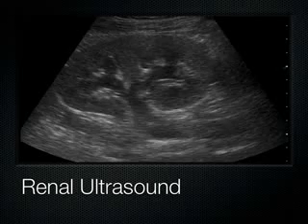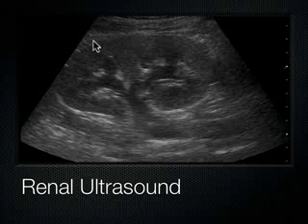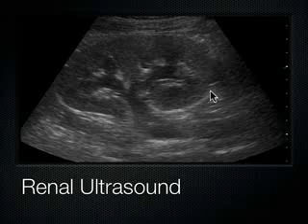And you could tell from this image right here, I don't know if you could tell, this is a kidney. And the kidney has some anatomy to it I'll go over. This is the capsule of the kidney out here. It's a very thick fibrous structure, and the capsule does not allow the kidney to expand very much.